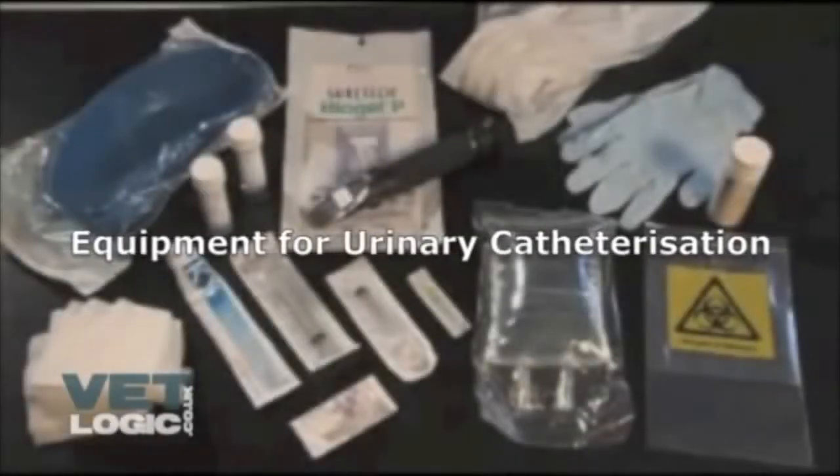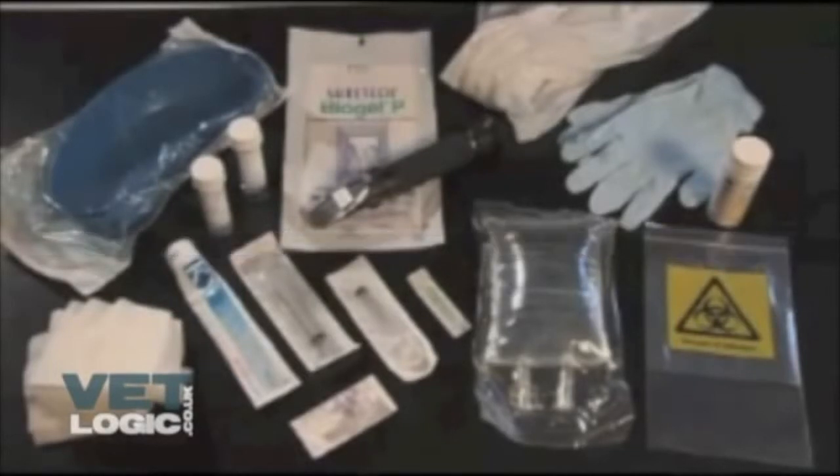Urinary catheters — equipment needed: kidney dish, swabs, KY jelly, universal container, sterile gloves, non-sterile gloves, sterile saline 500mls, apron.